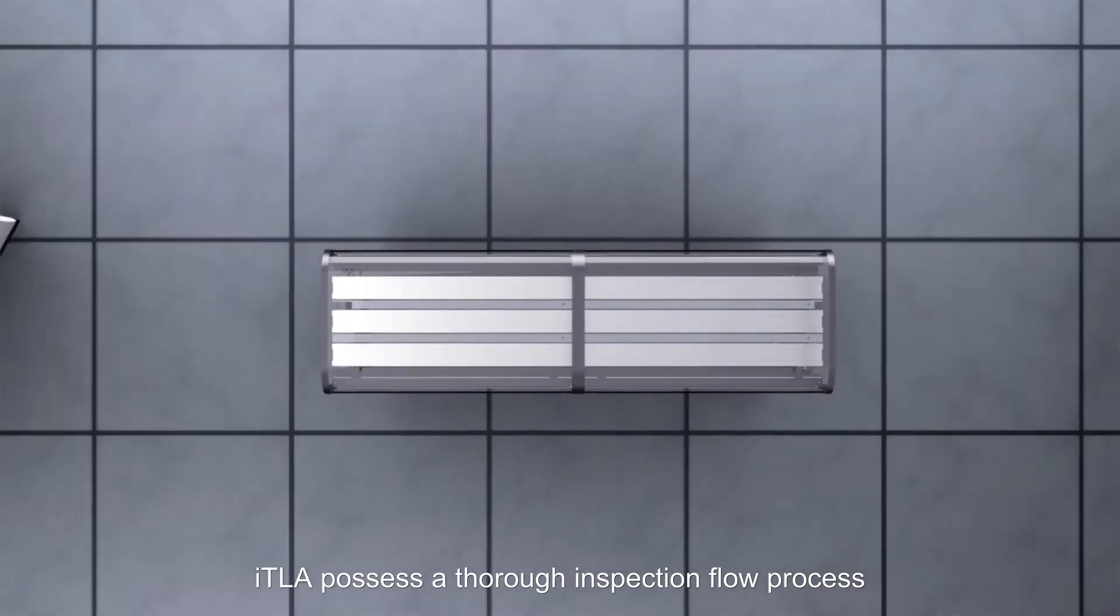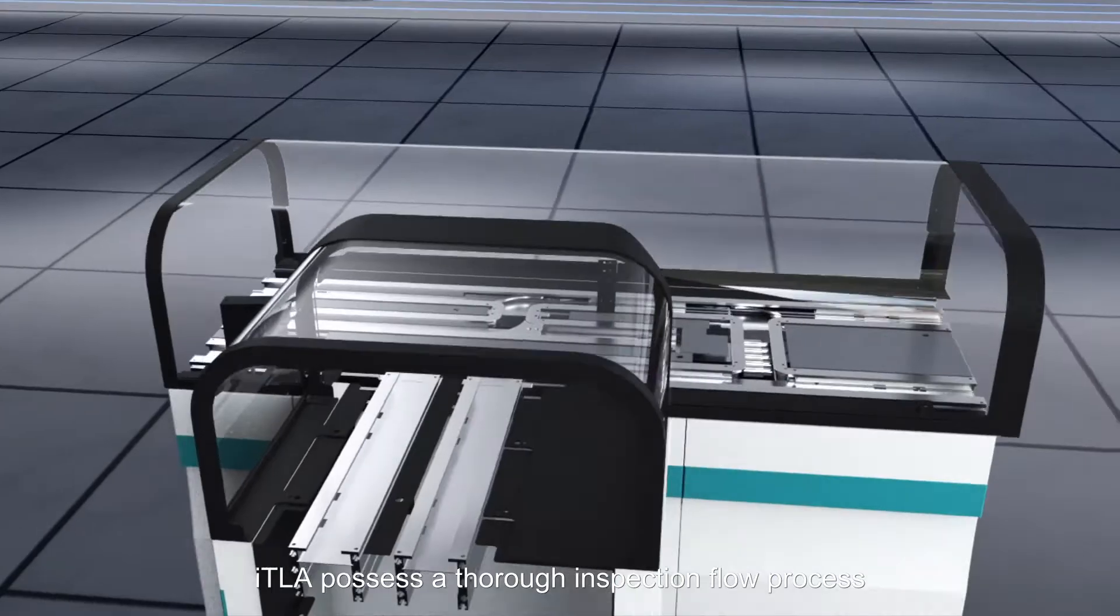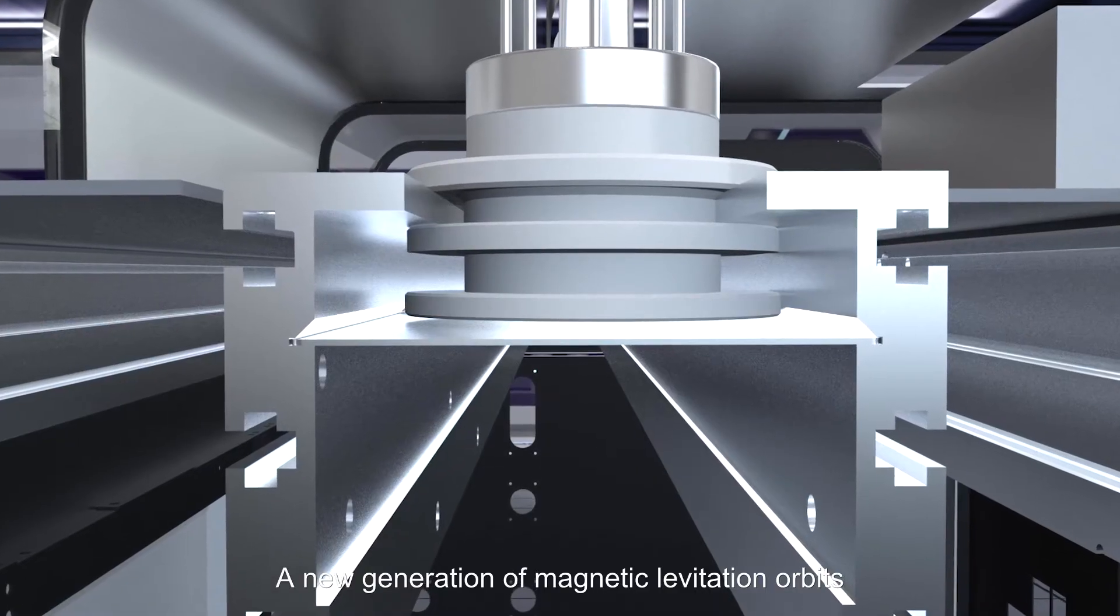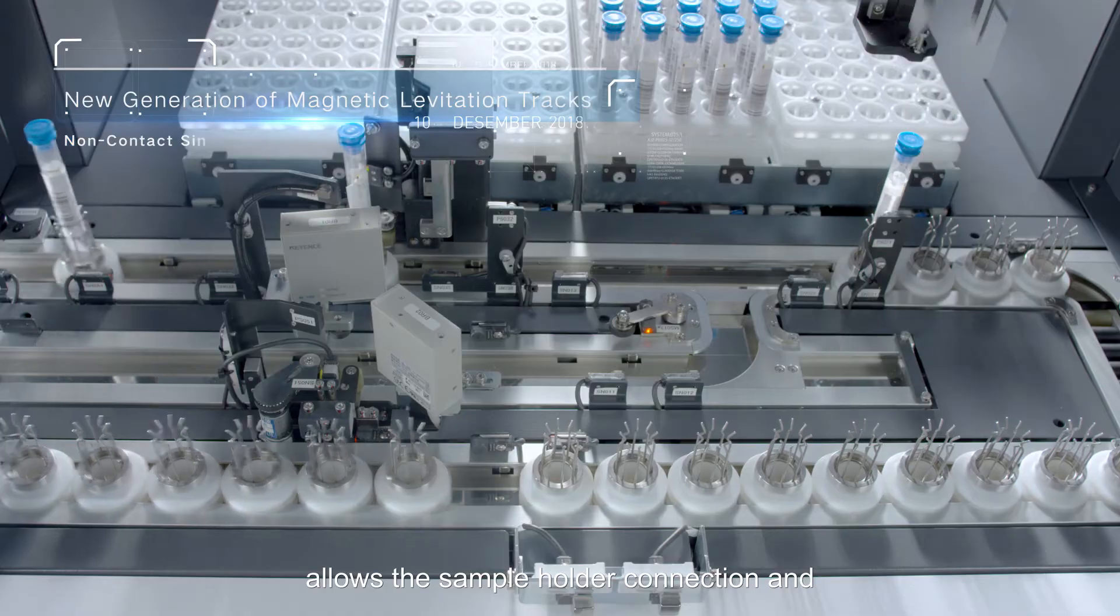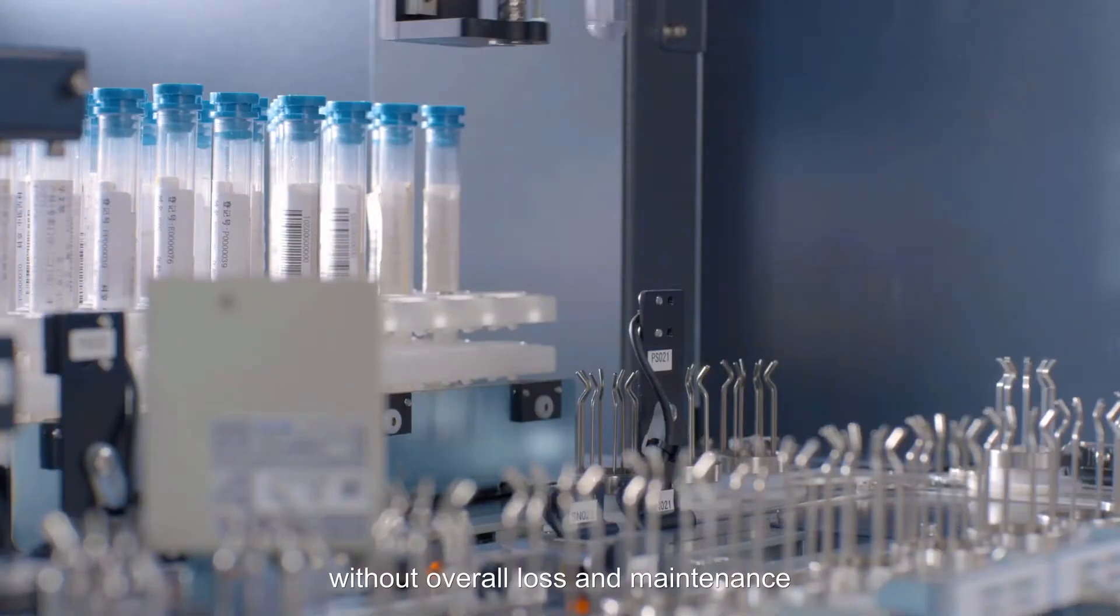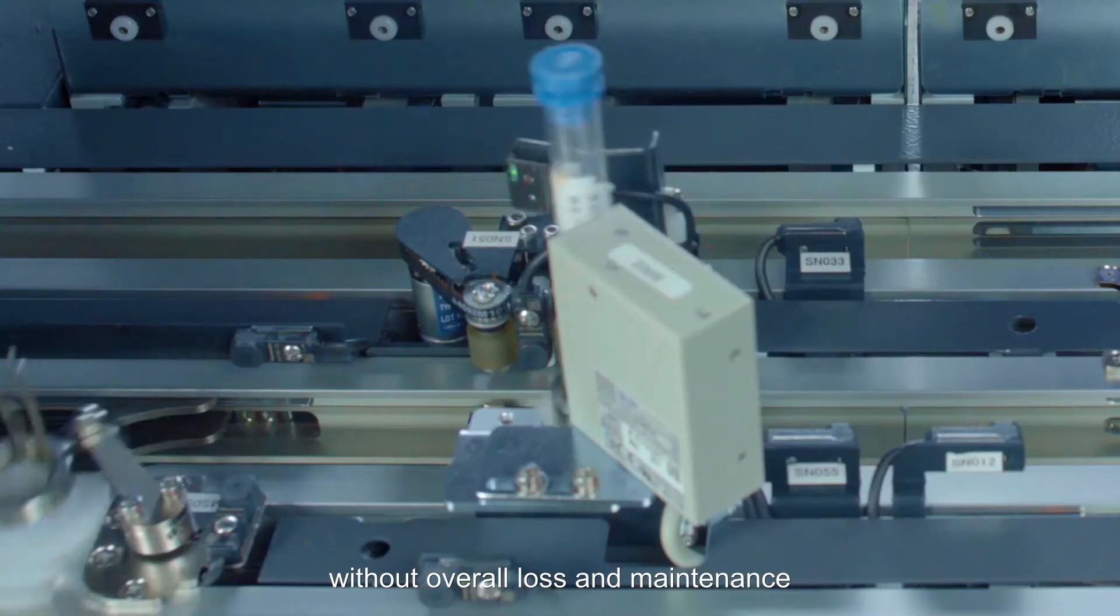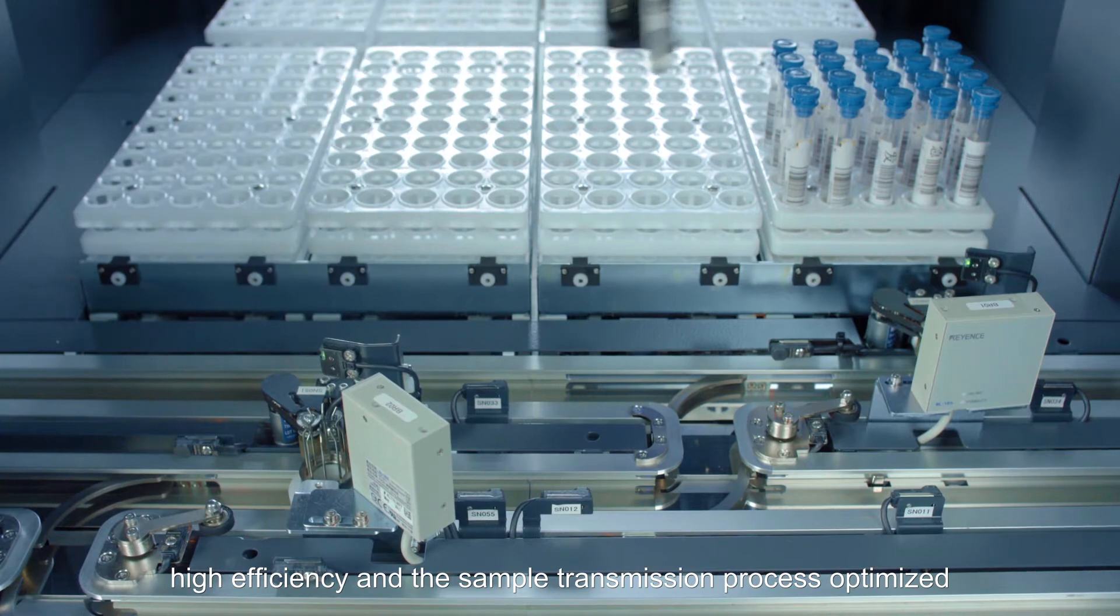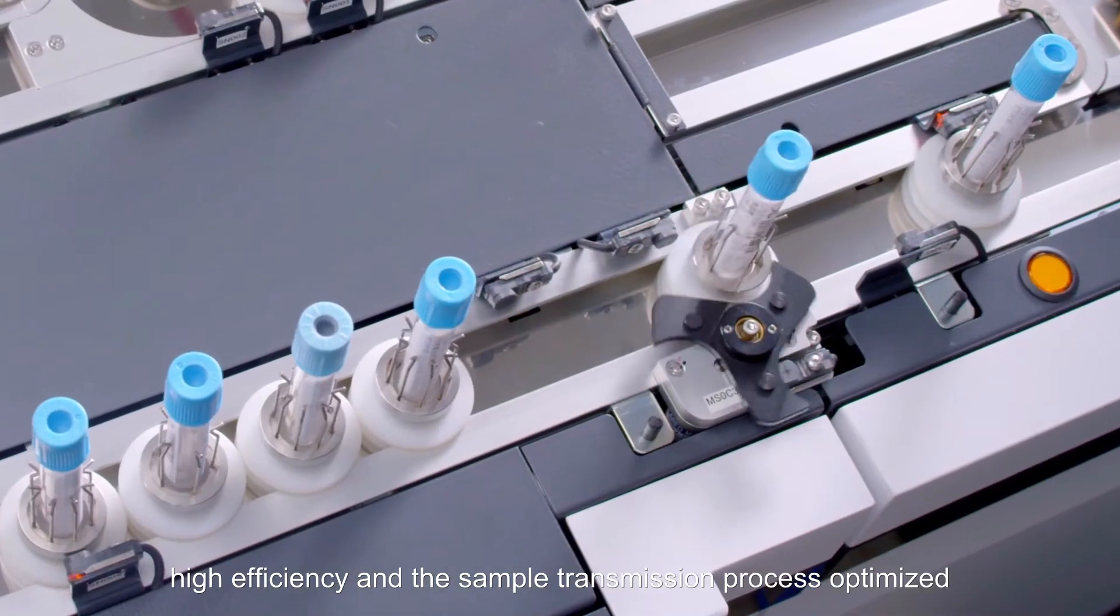ITLA possesses a thorough inspection flow process. A new generation of magnetic levitation orbits allows the sample holder connection and the bottom of the track to remain untouched without overall loss and maintenance. Single pipe transportation makes the sample scheduling highly efficient and the sample transmission process optimized.